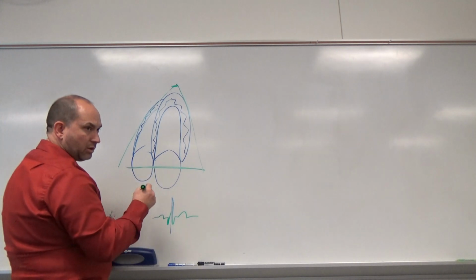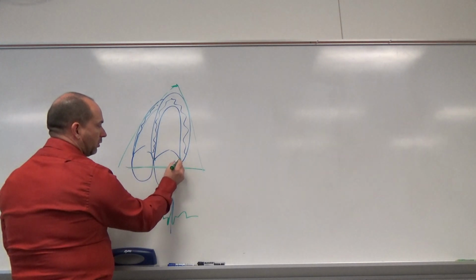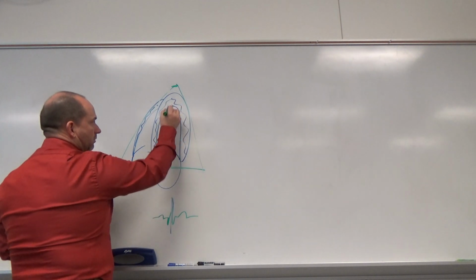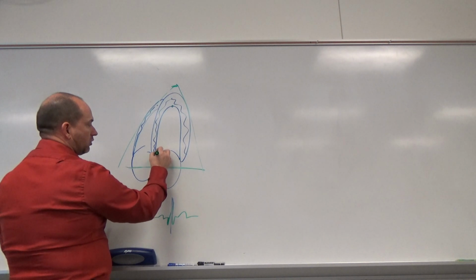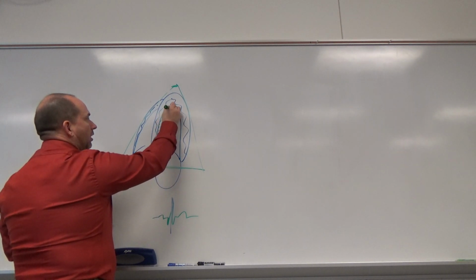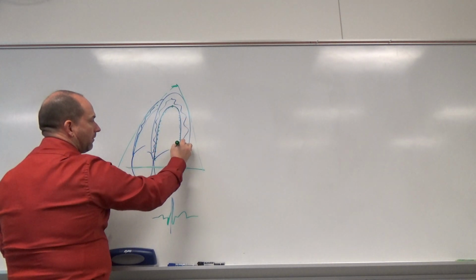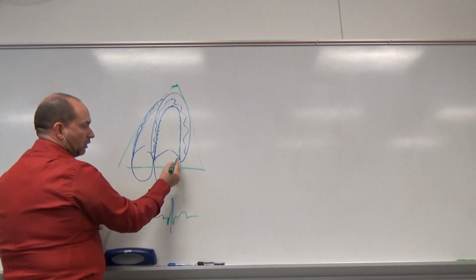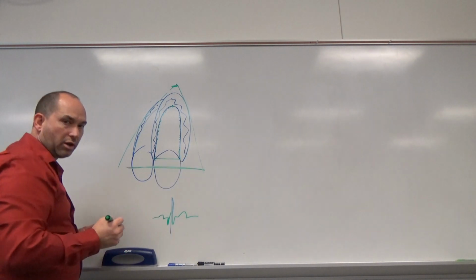The important parts on the Simpsons method of discs are the annulus on both sides and the peak, wherever that is. So we're going to start there, go into our calculation package, and trace all the way around the inside of that, ignoring any papillary muscles that might be evident there. Then we lock it on the other annulus, and it automatically draws a line across there.